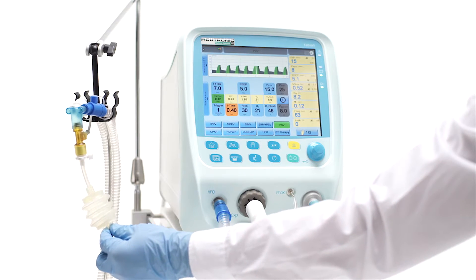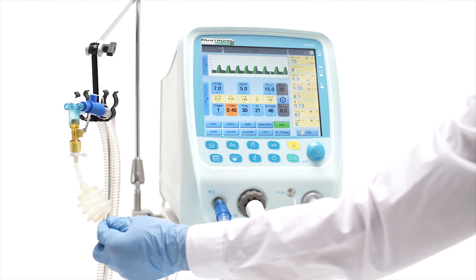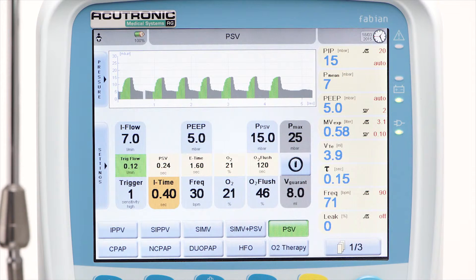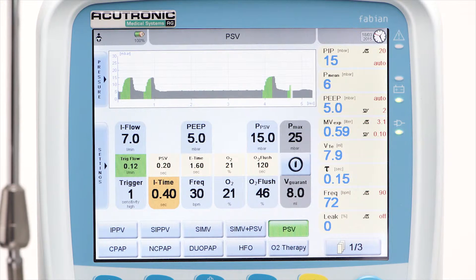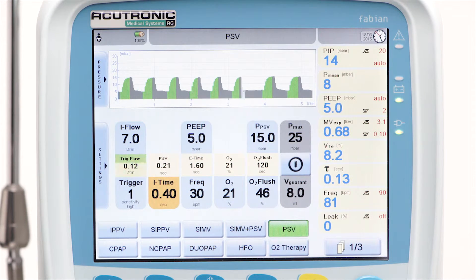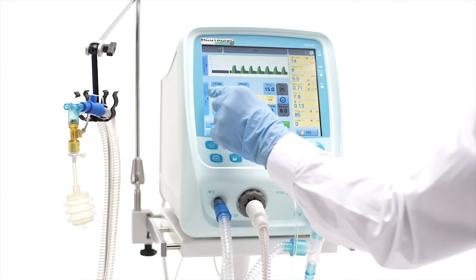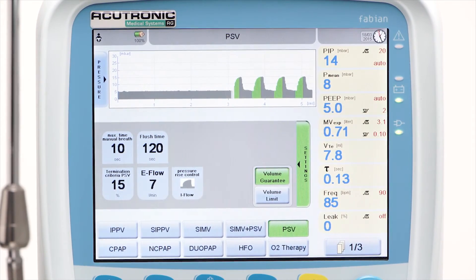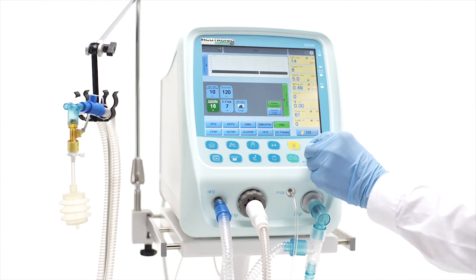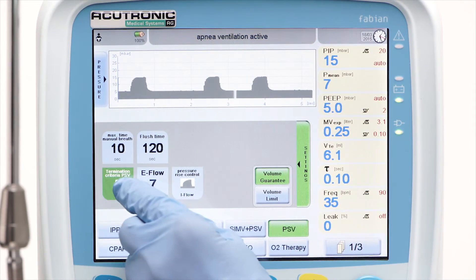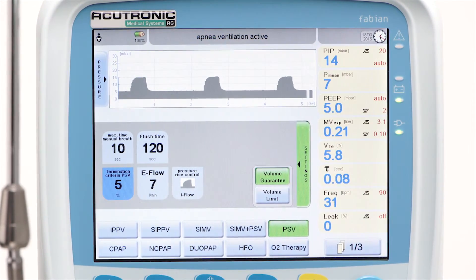For a fully synchronized assisted breath, PSV makes use of two triggers: the inspiratory trigger, as explained in SIPPV and SIMV, and the expiratory trigger, or flow termination criteria, adjustable in the additional settings window between 5 and 35%. Lower settings of termination criteria are more suitable for restrictive pulmonary diseases, as in RDS patients for example.